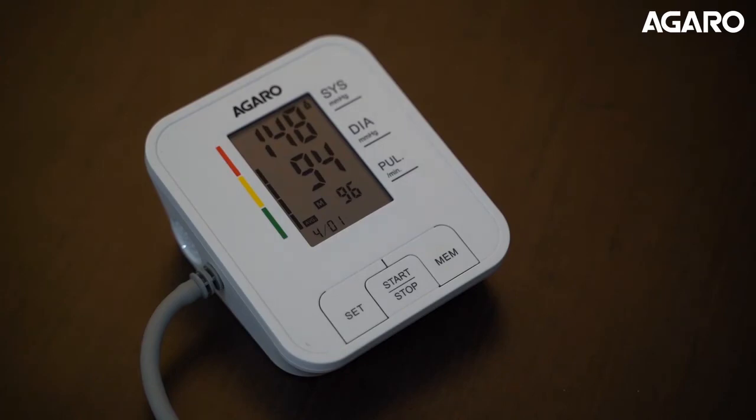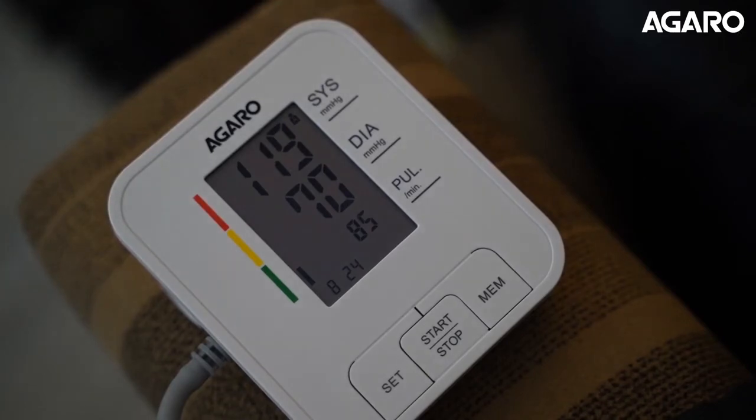You can also take an average of readings by memory, which helps eliminate any deviation in your measurements. With Agaro BP601 at your side, you can be assured of safe and reliable monitoring of your blood pressure.